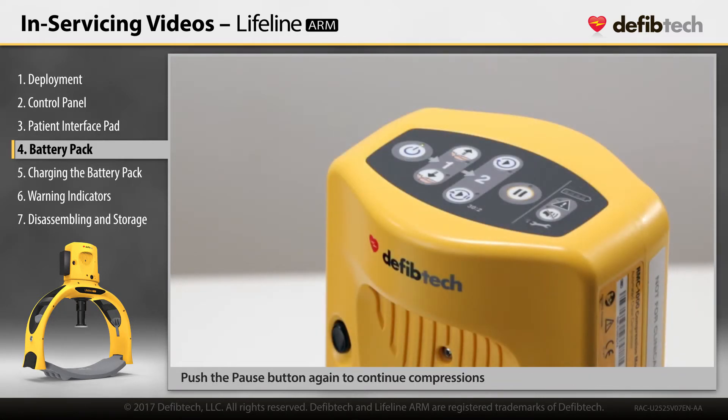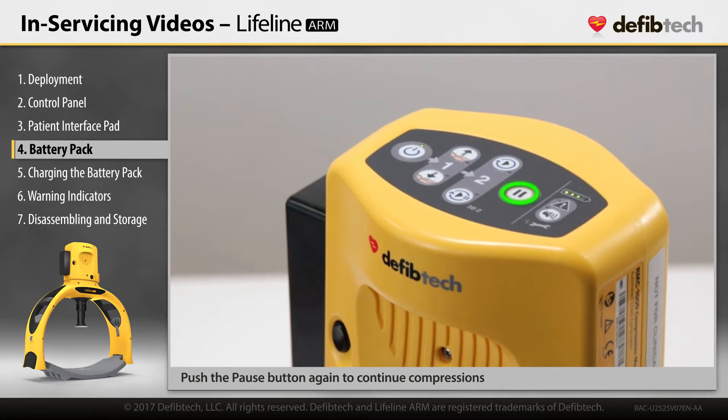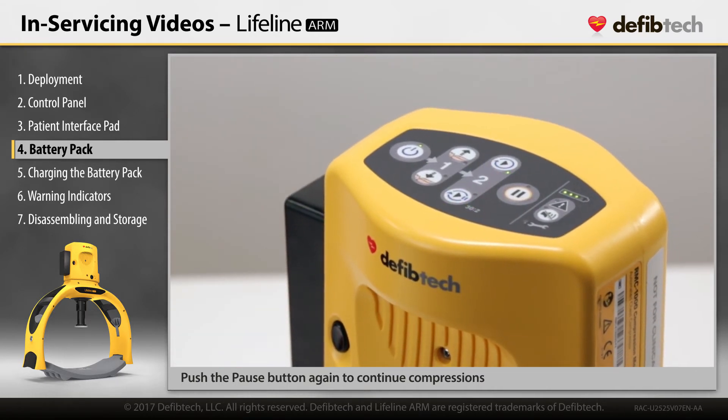If the device is in use, the pause LED indicator will illuminate after battery insertion. Push the pause button to restart compressions. Pushing one of the run buttons will also continue compressions.